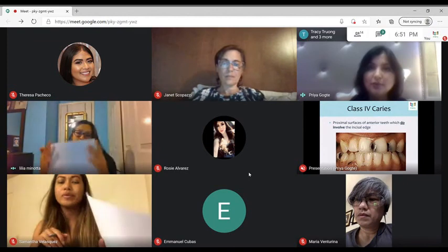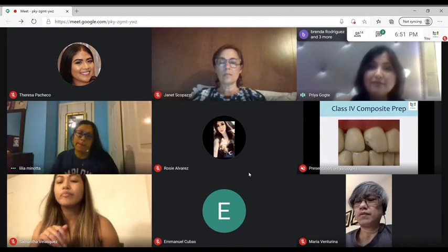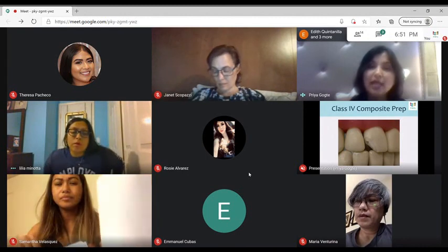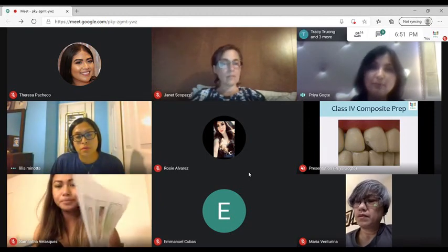So we talked about class 4s. Now this is class 4 composite prep. If you notice, the bevel is a lot in class 4 composites. In class 3, actually nowadays a lot of schools are teaching not to even place a bevel.